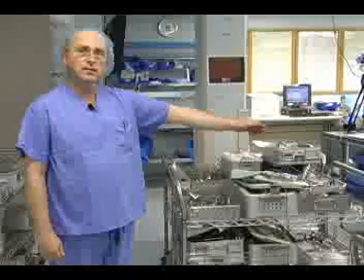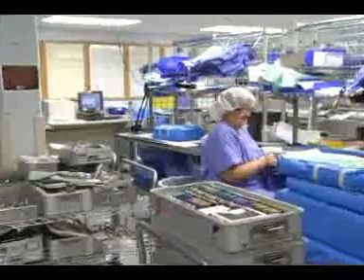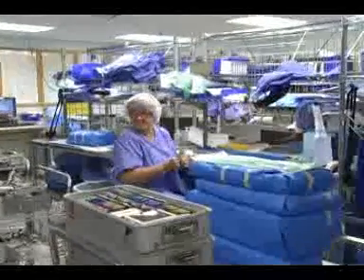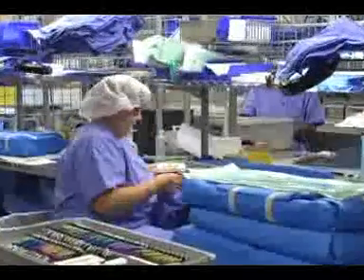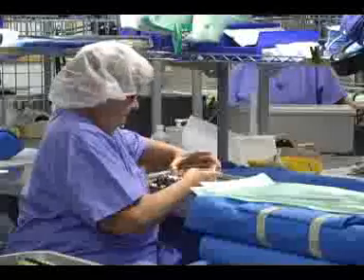Then each assembler, like Joanie sitting here, re-assembles the trays. Most trays have a sheet that tells you exactly what to put in them, but not all of them. After she inspects it and makes sure it's clean and dry, she'll proceed to re-wrap it in this blue wrap.